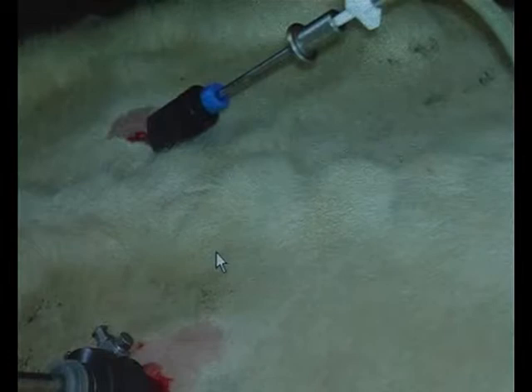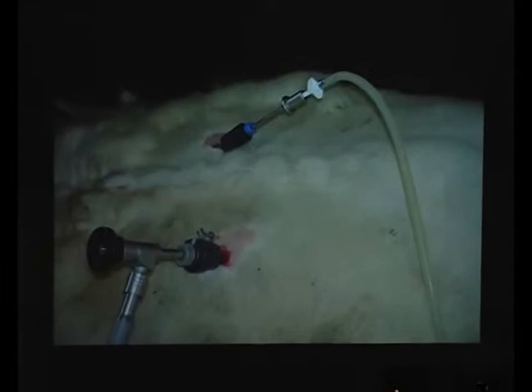abomasum. If you want to fix the not displaced abomasum, it is important to bring the toggle directly into the lumen, and it's often difficult to do this, so we take chains and insufflate the abomasum directly. We do this with our toggle setting trocar. We puncture the abomasum near the omasum and insufflate air. We will do it later. And you will see, you get a nice displaced abomasum. We create our abomasal displacement.